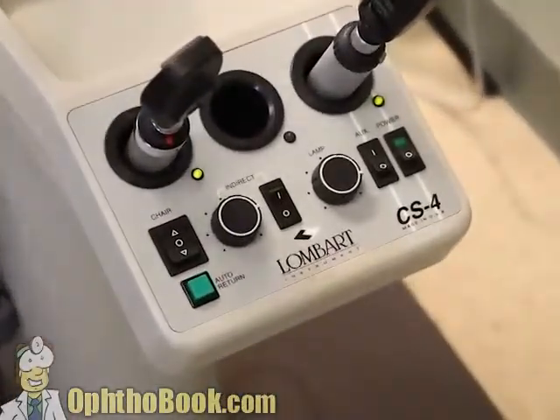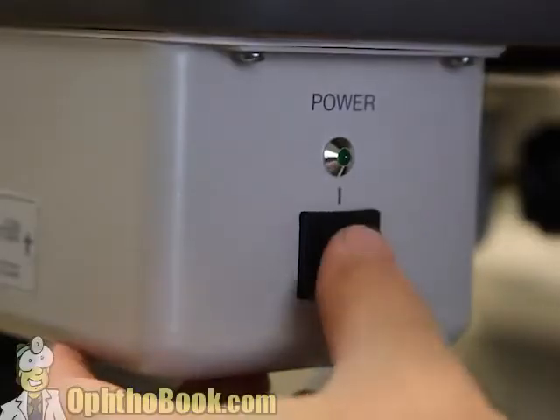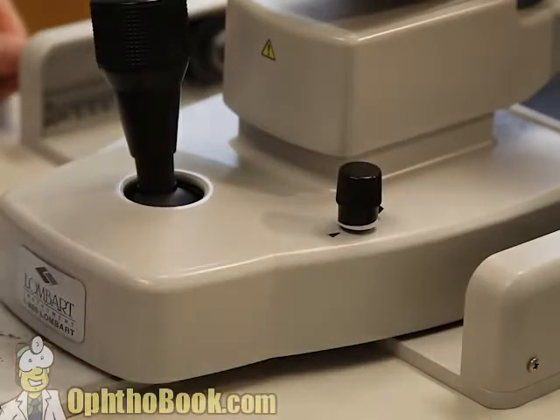Then you need to learn how to turn your light on. There's usually an on button on our central console here. Underneath the table itself, there's usually another on button. And then you need to track down the rheostat, and that controls the actual intensity of light. It's often under the table, but sometimes, at least on this unit, it's actually on the base itself, which is quite convenient.